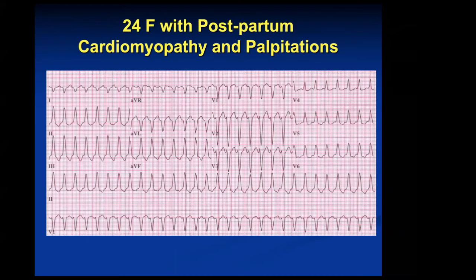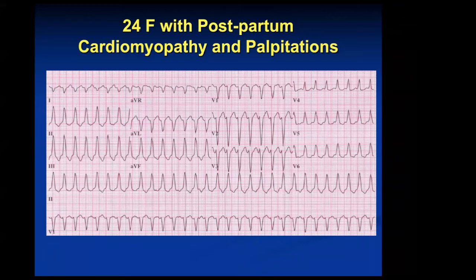A 24-year-old woman with postpartum cardiomyopathy and palpitations. Is this a narrow or wide complex tachycardia? It's wide. Given that history, what's high in your differential? VT — exactly right. Because you have cardiomyopathy with a wide complex tachycardia that's regular, VT is high in your differential. Putting together the fact they have a cardiomyopathy, a regular wide complex tachycardia — that really raises a high index of suspicion for VT.